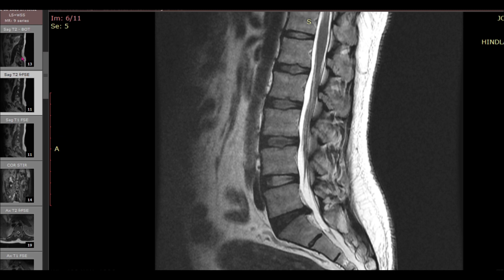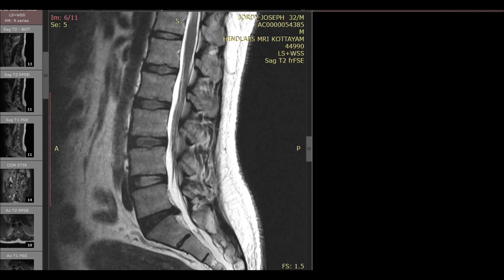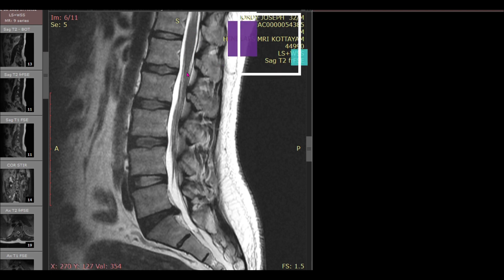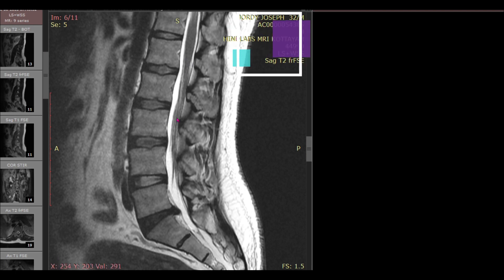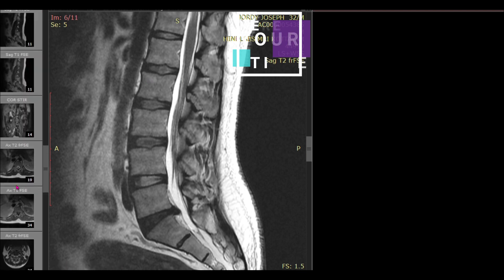The sequences I use — and generally most radiologists use — are sagittal and axial correlated images in T2 as well as T1. Sometimes, if you are suspecting cord edema, you can also use STIR images to confirm that, or even to see whether there is a marrow edema or Modic-type change.